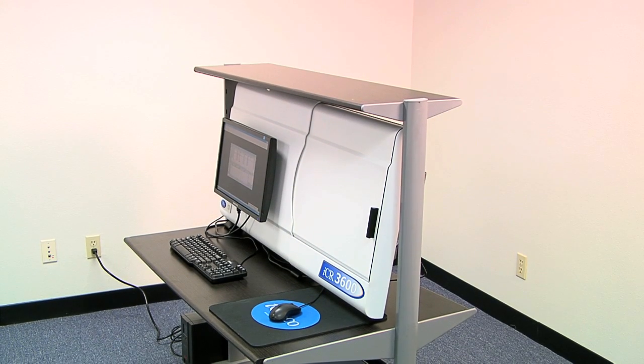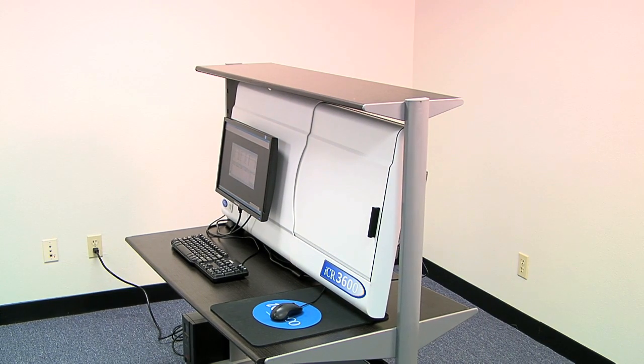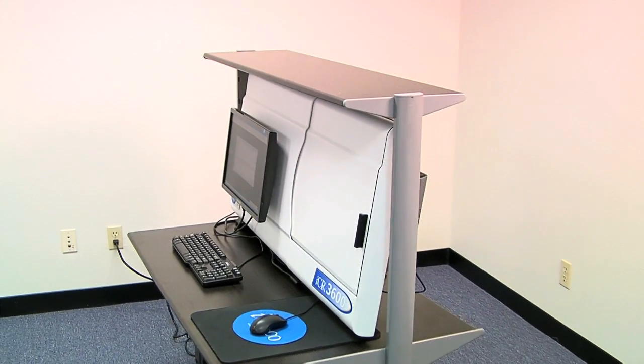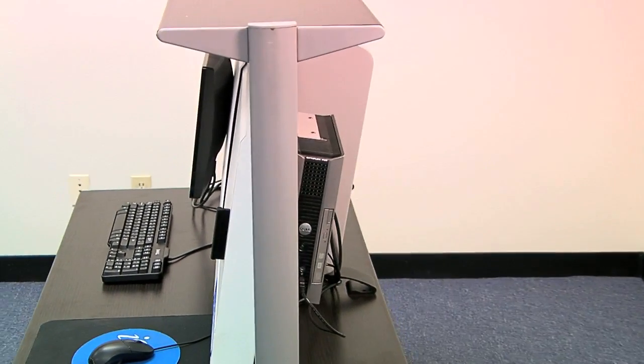Today we will demonstrate how the ICR 3600 operates. ICR 3600 is the slimmest and the only wall-mountable CR in the market. As you can see here, you can mount the monitor and the computer on the CR, which makes this machine a true space saver.